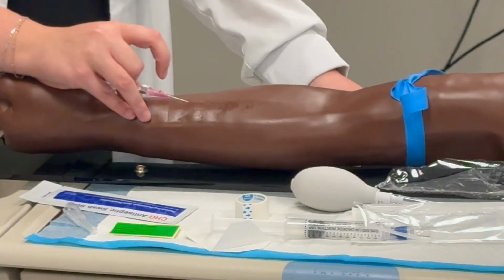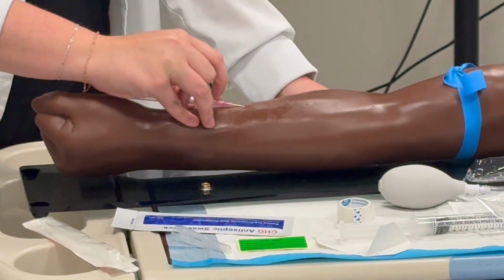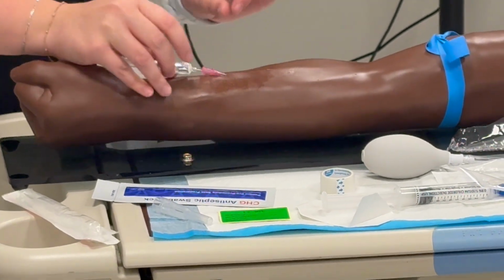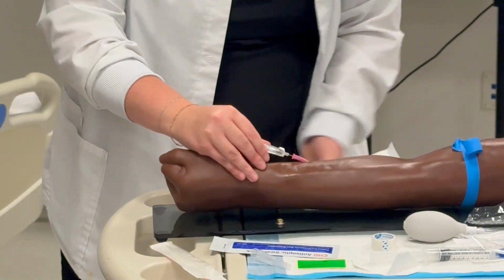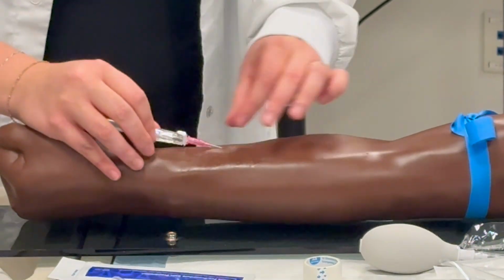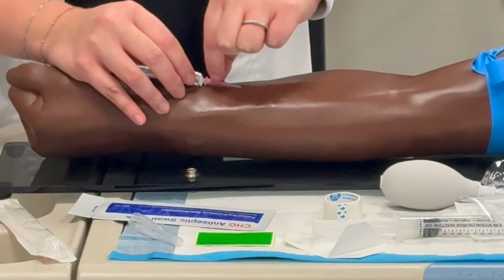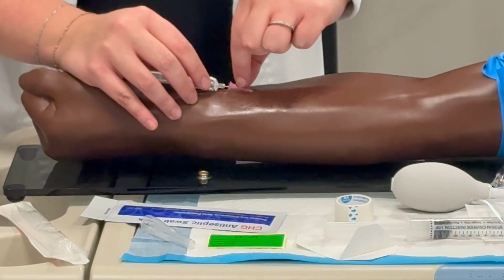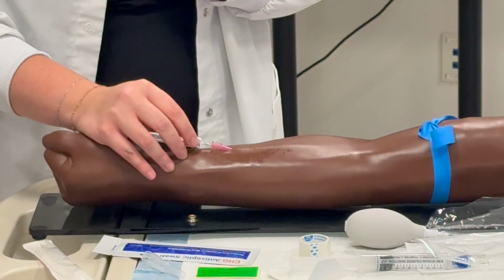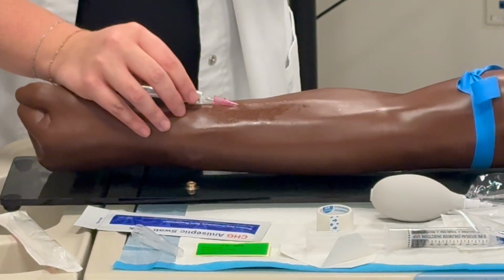Can you see, McKinley? Sorry, I just realized. So this little notch is what you're going to use to thread. You can thread with your finger like this, or, sorry guys, I changed the angle. Or, obviously you aren't gonna be doing all this touching. Or you can, like this with your fingers, pinching right here, thread until the hub, which is the opening, is to the skin. So there's only one part of the IV moving when she does that. It's not both parts moving away from each other, just the one pink part is moving in.